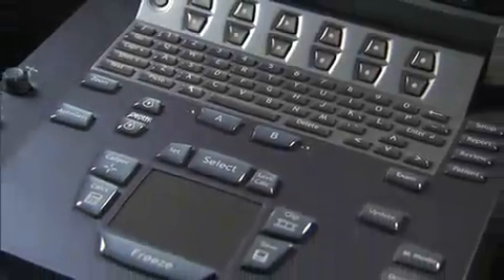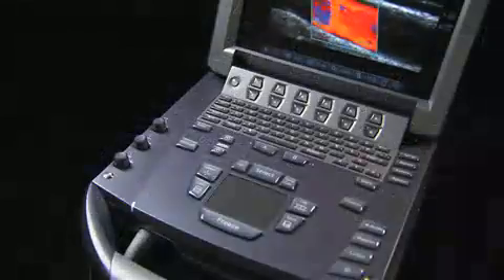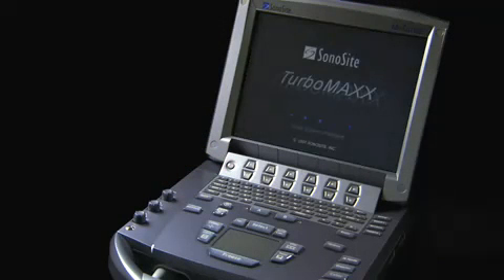The system control panel is simple to use. Many controls and features are automated to simplify the user interface and minimize the number of keys, and the keys are backlit for easy viewing in darker environments. To turn the system on, press the power key once. The system will power up completely in 15 seconds.